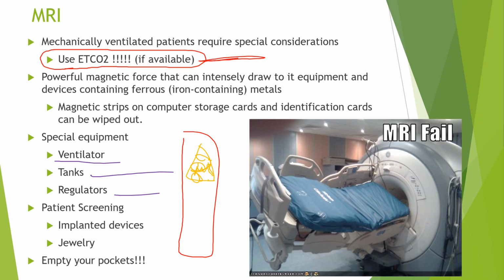Now, most jewelry these days is non-ferrous. There might be some, but a lot of times the jewelry in there is like dermals, things like that. Crazy that I know this, but go to MRI enough and you'll get to know all this. A lot of the jewelry is non-ferrous, so you just have to be aware of the jewelry, especially of the nurse or whoever is going in there, male or female, whoever, right? You just have to be aware of that.